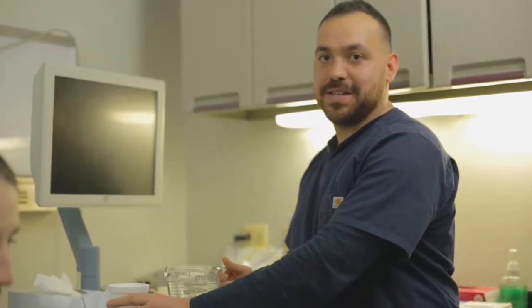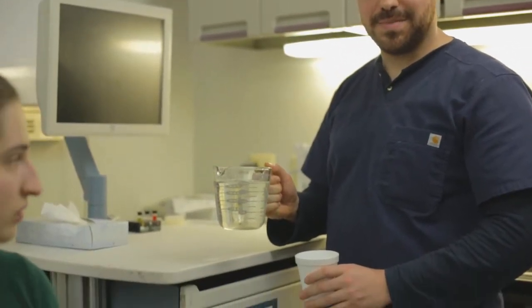After the baseline is finished, you want to do a water load on the patient, which is basically just filling them up on water and measuring the amount of water they drink with a measuring glass of some sort.